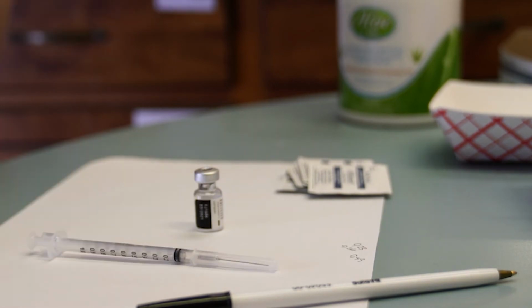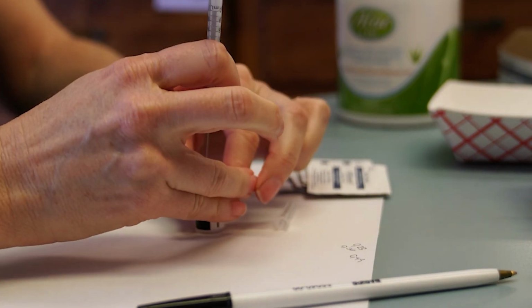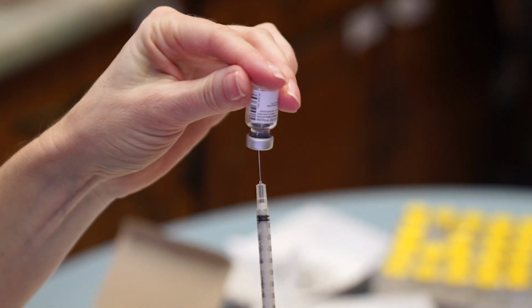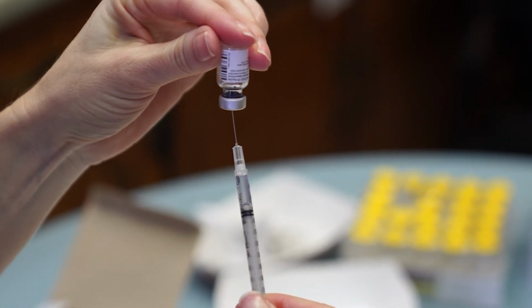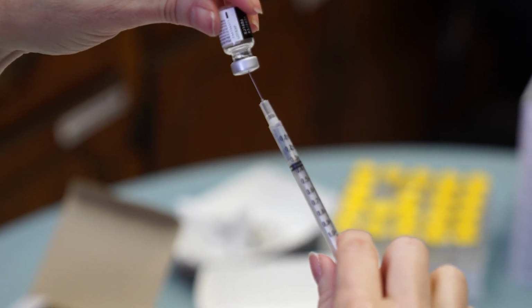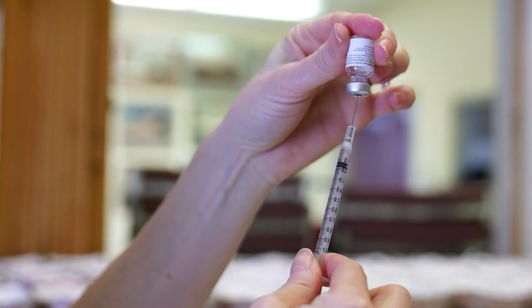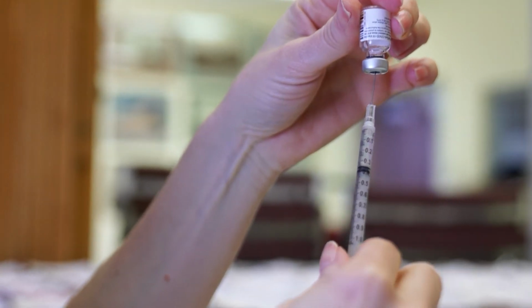On your 6th and potentially 7th dose, insert your needle into a new spot on the rubber stopper close to the edge. Invert the vial and slowly rotate the vial in your non-dominant hand in an effort to collect all the tiny bits of vaccine from every area of the vial. You need all this fluid in one spot to have any hope of obtaining this extra dose. Tilt the vial on its side and position the bevel of the needle in the remaining fluid, where it is likely pooled beside the rim of the stopper. Very gently and very slowly, pull back to collect every drop. You may need to rotate the vial as you pull back, and you may need to push the fluid gently back in and re-rotate to collect a drop that is stuck on the side of the vial.